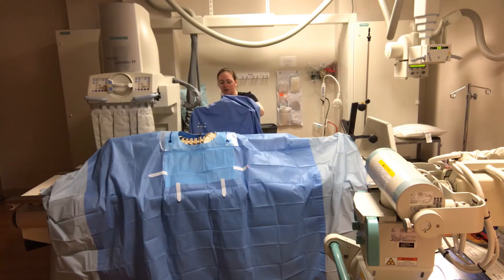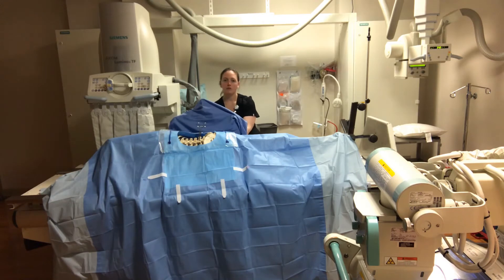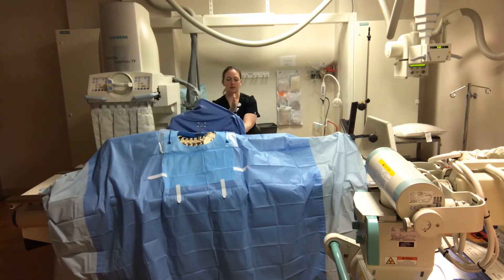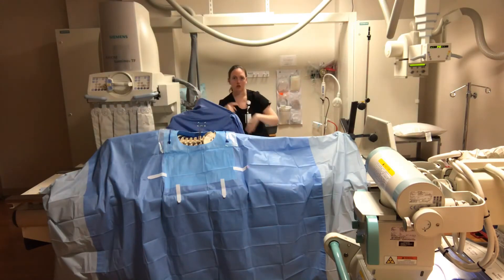Push it flush against the table. I feel underneath the sterile drape and feel for the table, going flush to the table. I show whoever's working with me where the top corners of my cassette are, and I put the bottom of my cassette where the slope of the butt is on the patient — where the butt leads to the legs. I put the bottom of my cassette there, right up against it, making sure I'm not crooked for grid lines.